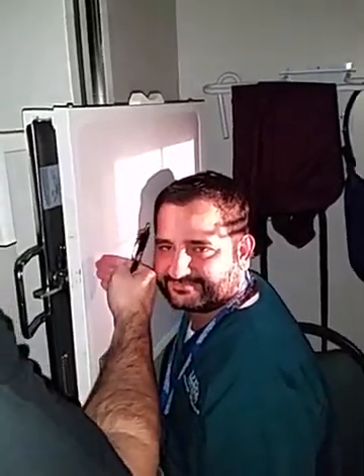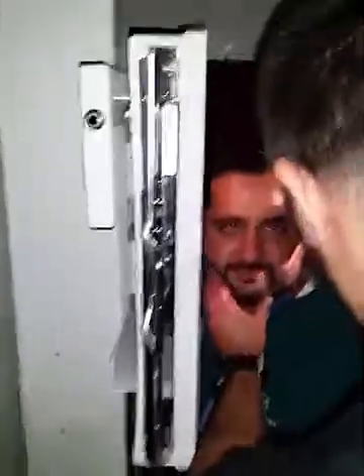Put your cheek down. Yeah, we're punishing our patient, sorry. But his face is rotated closer to the IR than it is out here. It should be even, right? And he looks like he might have a slight bit of tilt, maybe. So let's see. I'll adjust you. There you go.